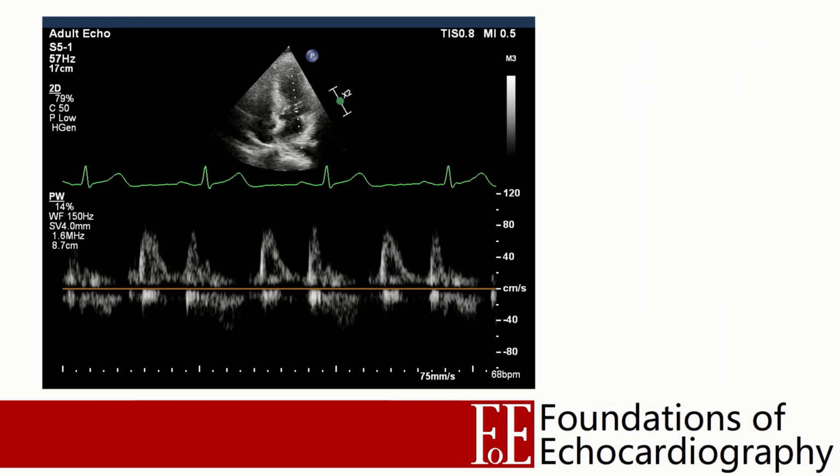Here we have pulse wave Doppler of LV filling during diastole. The graph displays all of the information that we might want. However, there is a lot of space that's being wasted which we could use. When making measurements from 2D clips, we often zoom in on the region of interest in order to maximize the precision of our measurement, and the same principle applies here.